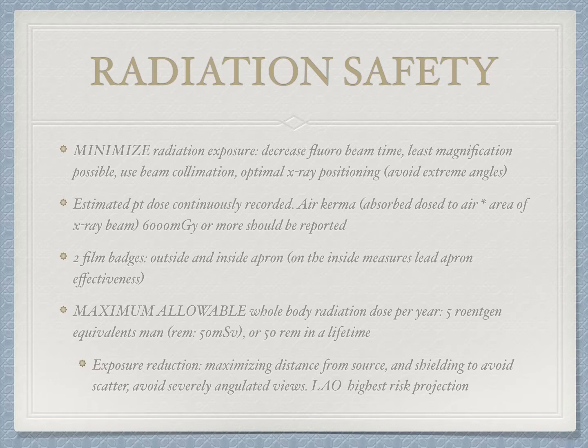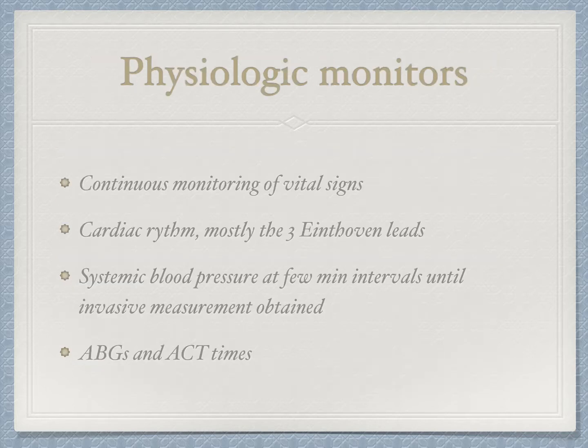How can the people who are working here reduce exposure? Maximize the distance from the source and use shielding to avoid scatter. Avoid severely angulated views. What about physiologic monitoring of the patient?